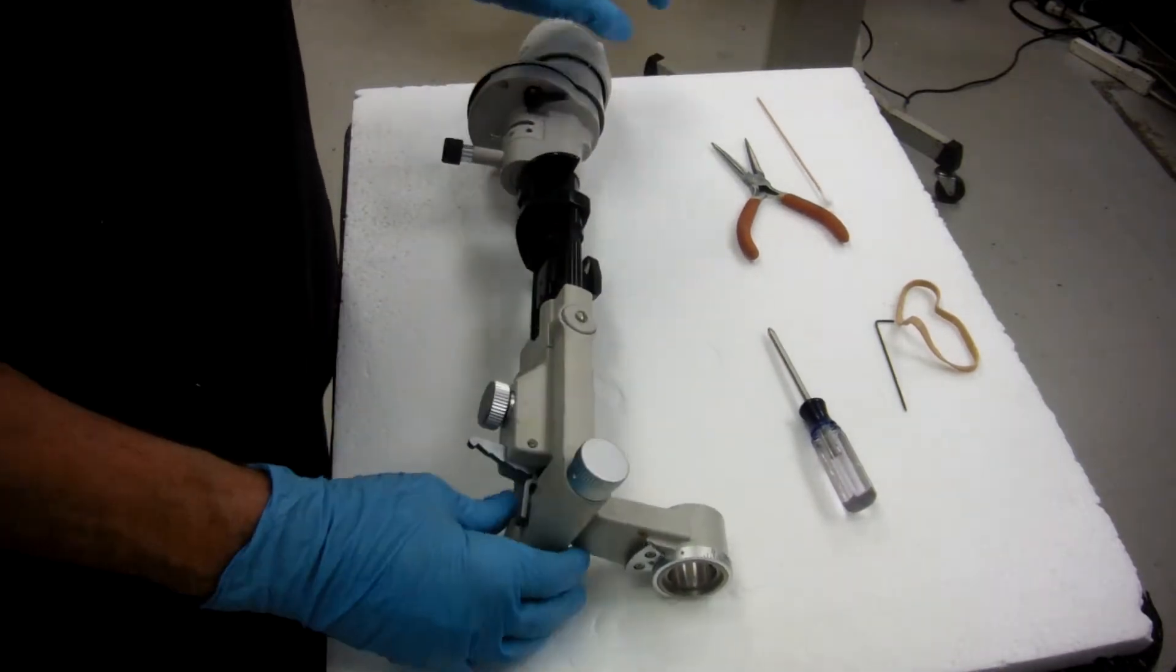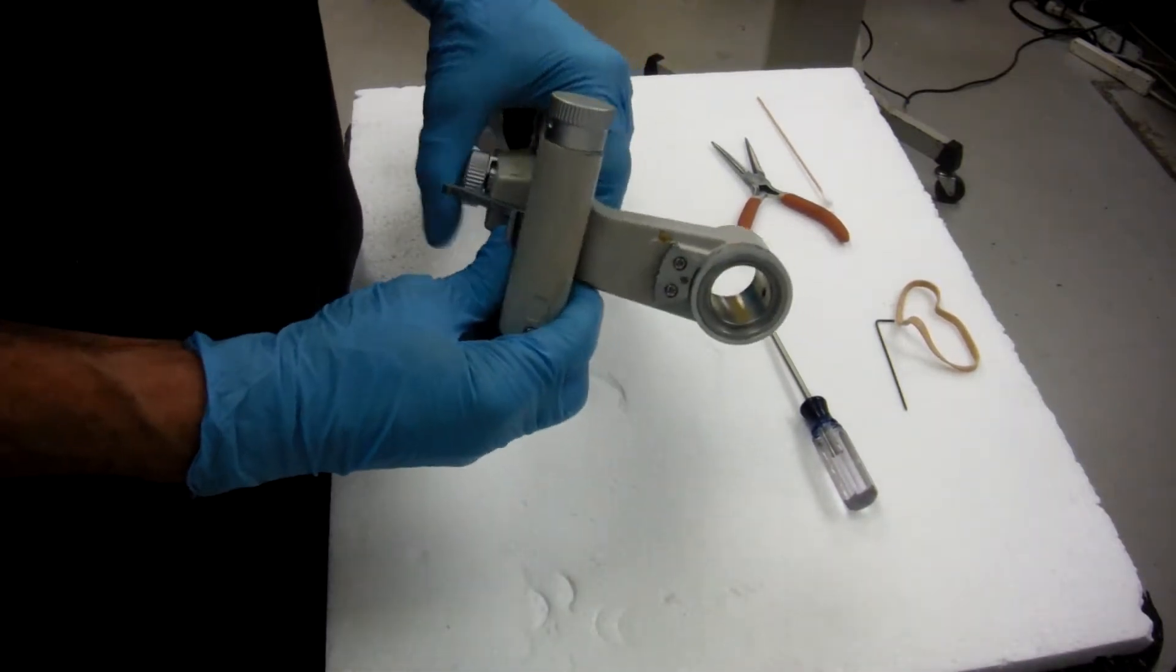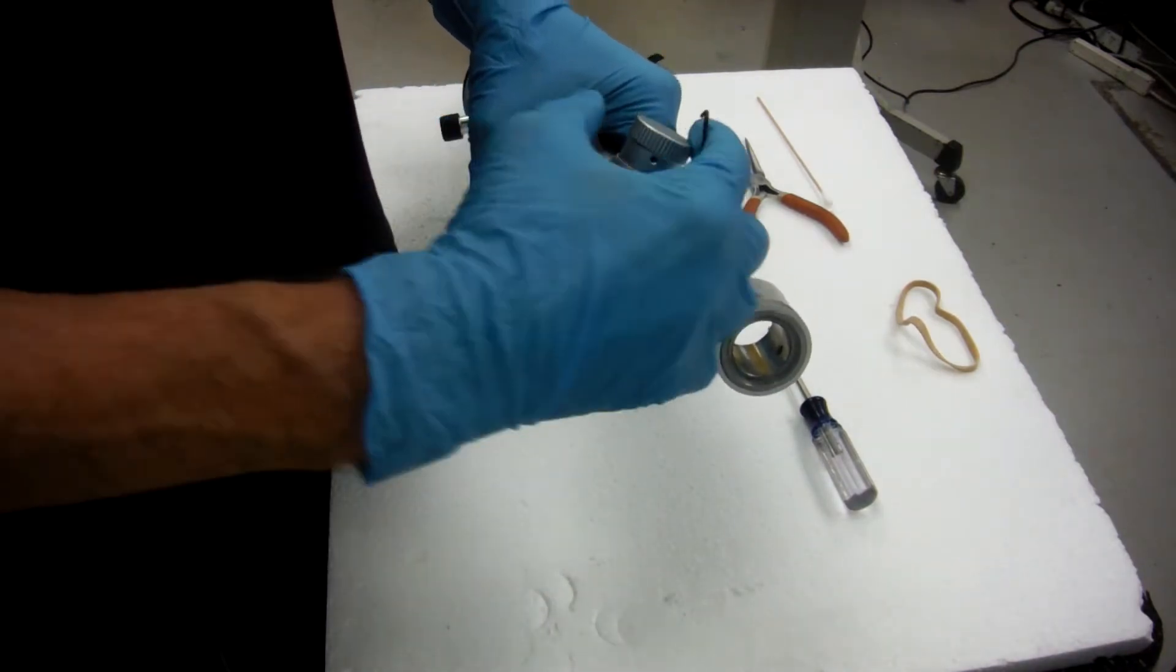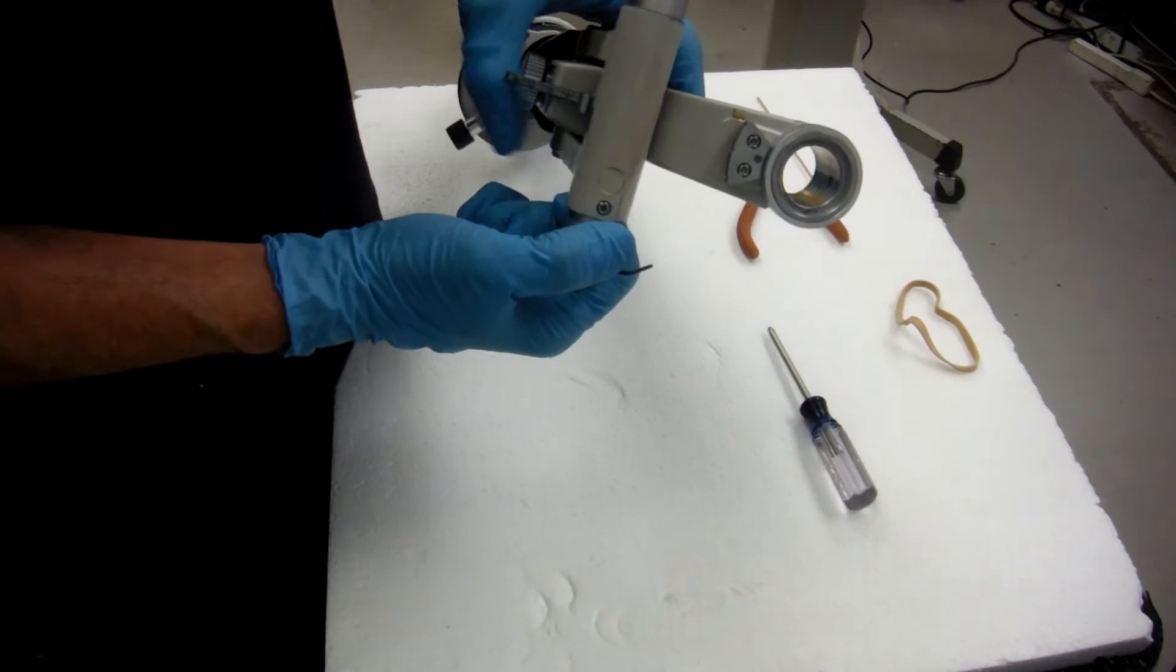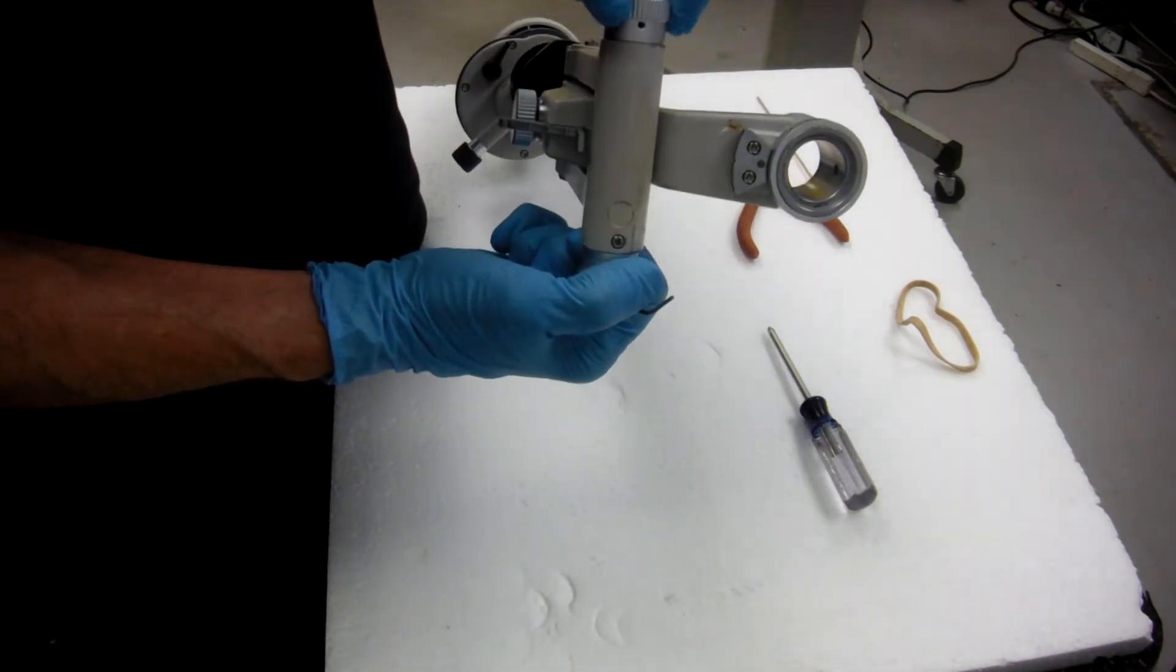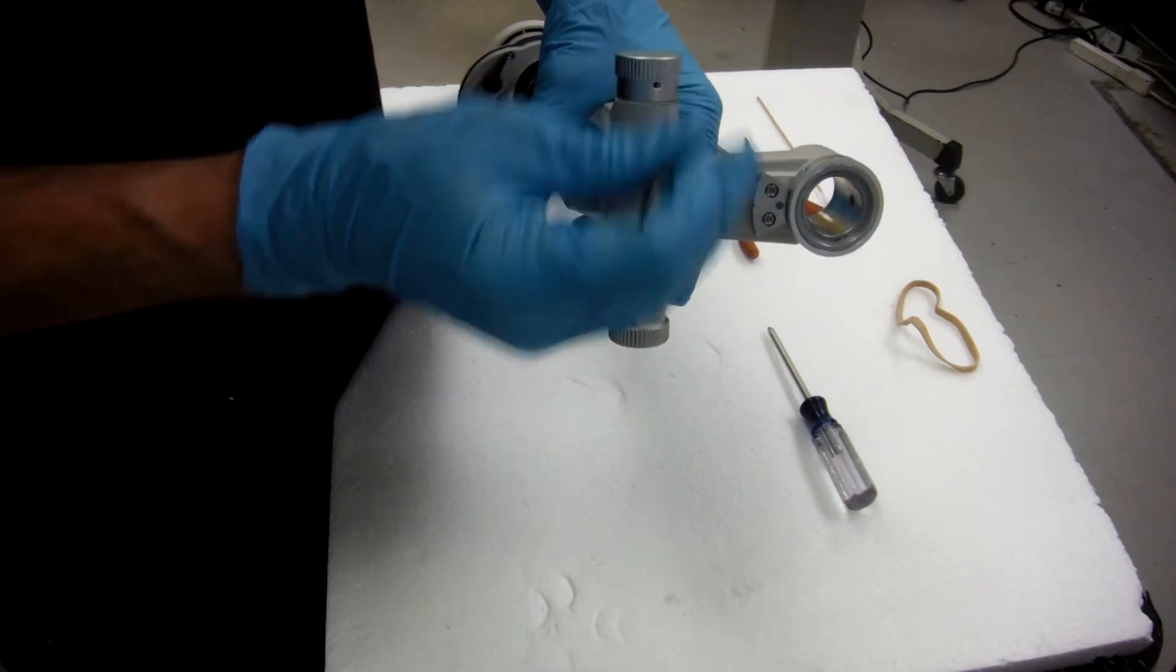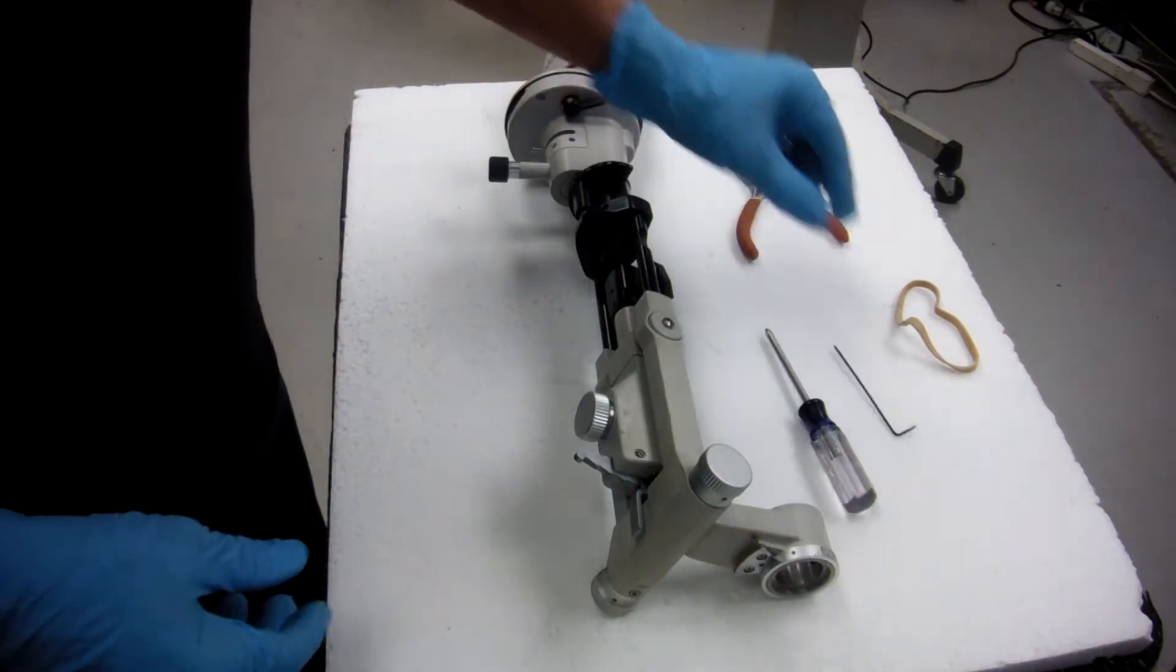You can adjust the tension by loosening this Allen, holding this in, and turning it, tightening it a little bit, and then lock it back in. That will increase your tension.